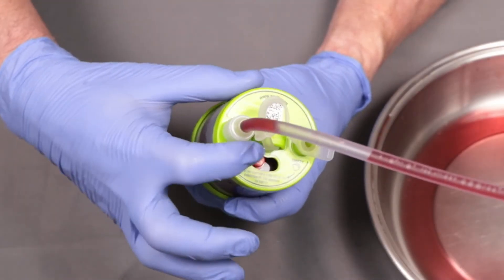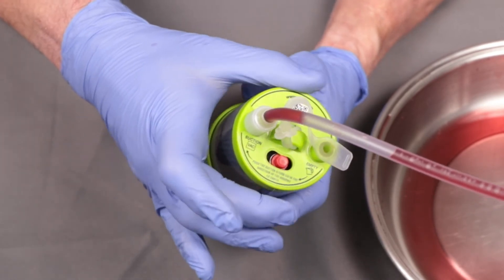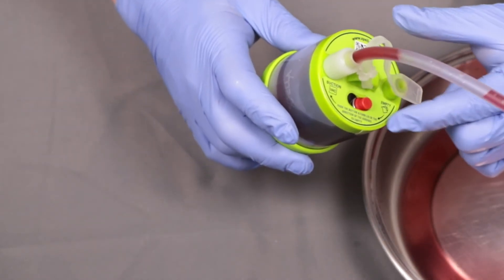When the reservoir needs emptying, hold the red button down and twist the lid to the opposite side. The button will move to the empty position.